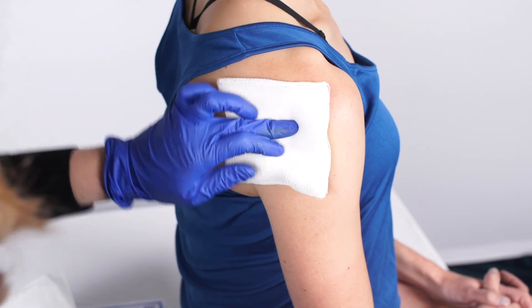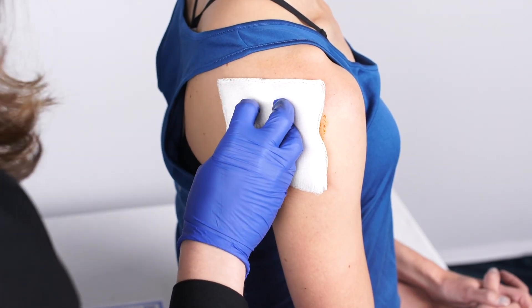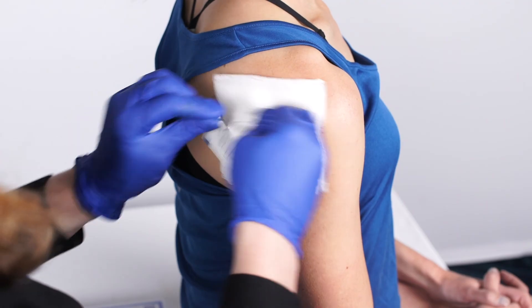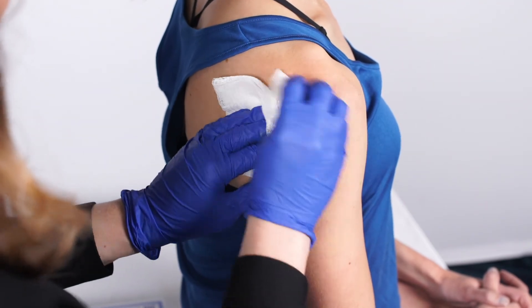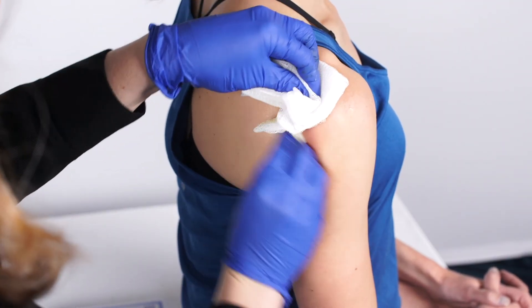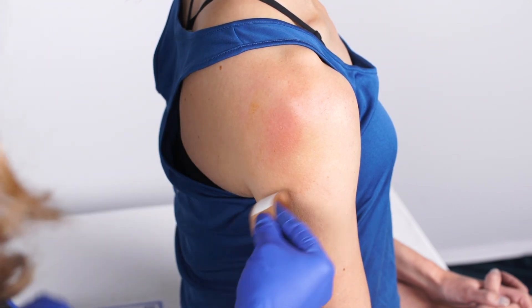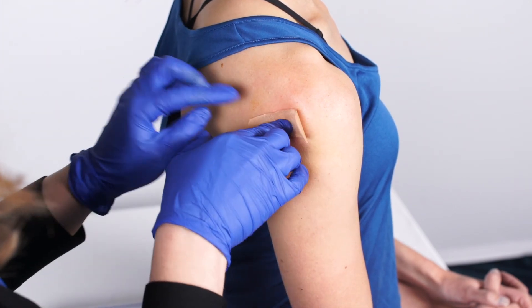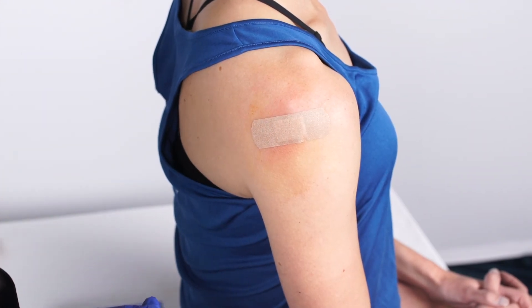After the needle is out, put a 4x4 down and then clean with iodine around the spot. Sometimes you have to really scrub to get the iodine off, so hold the 4x4 down, keep everything clean, then scrub off the iodine and place a band-aid over the spot. I let the patient know they can take the band-aid off tomorrow — 24 hours and you're done.